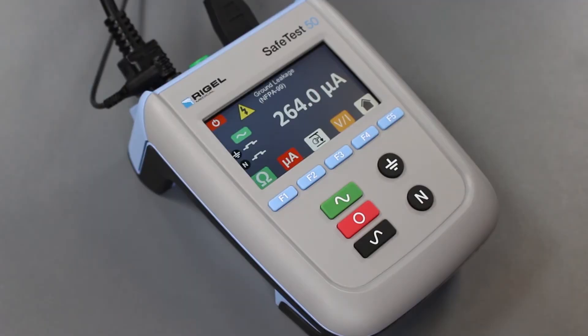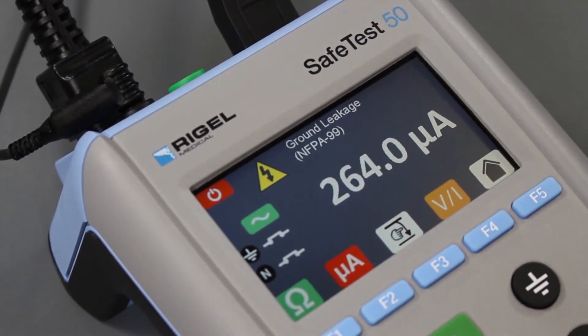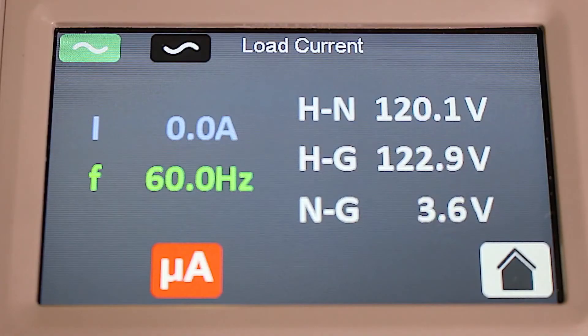Line voltage, frequency, and load current of the equipment under test are clearly shown on the display by pressing the VI button, while the clear color screen displays accurate test results which are easy to read.